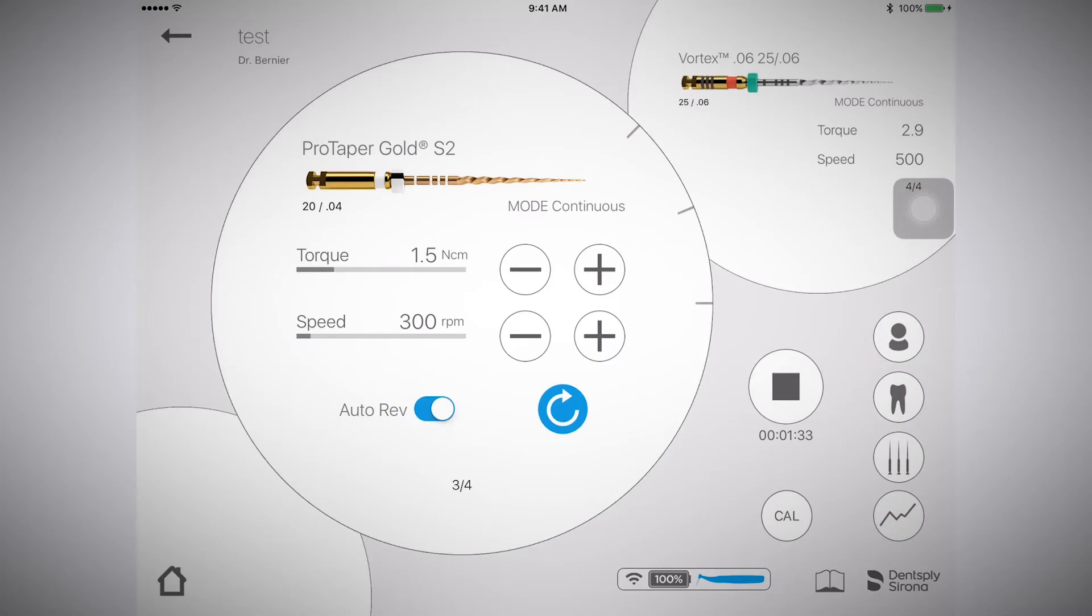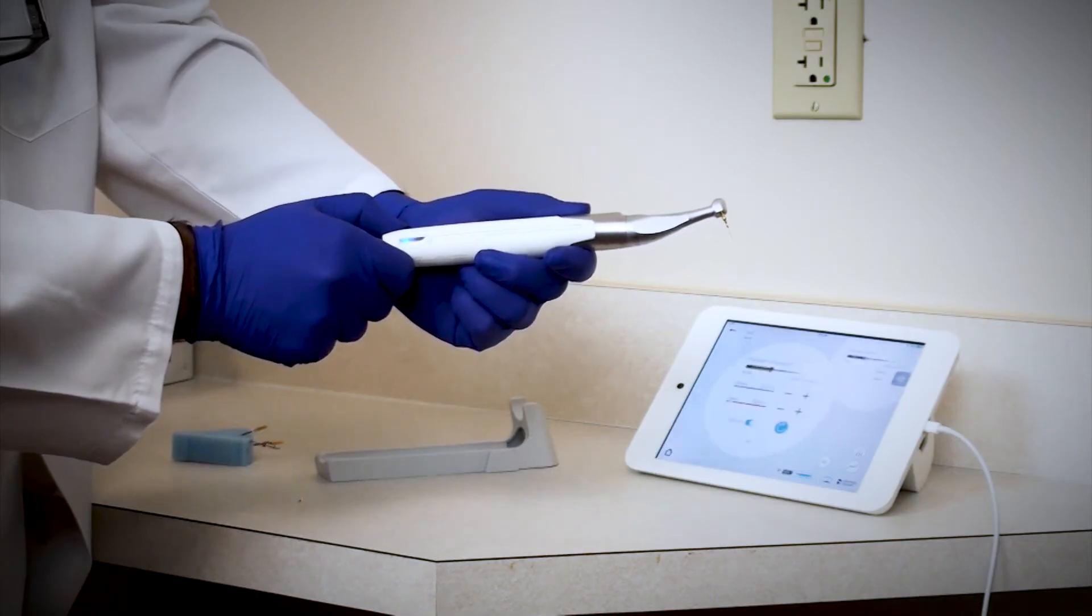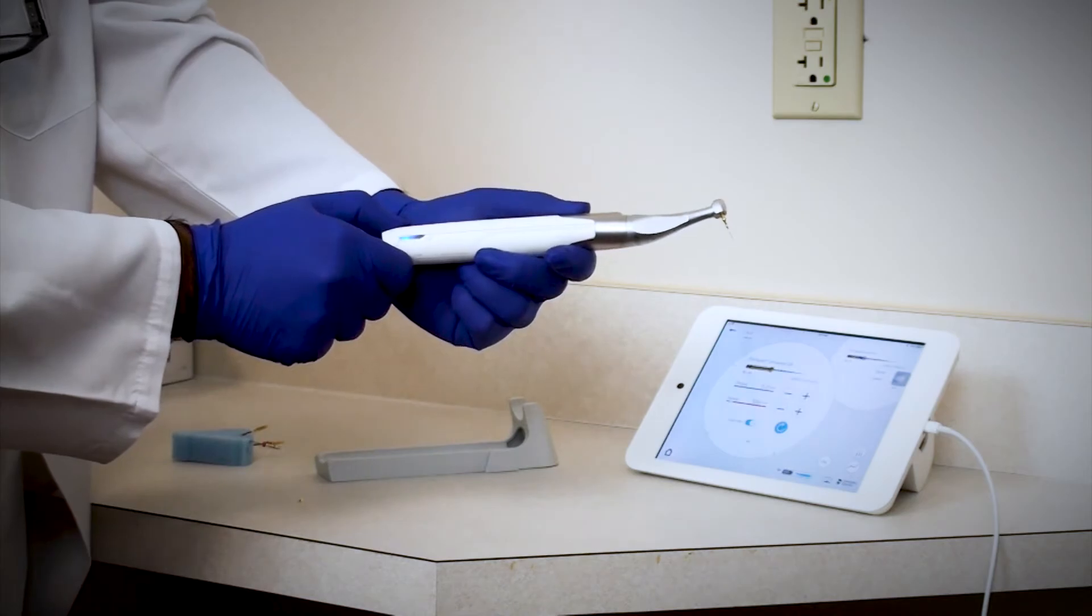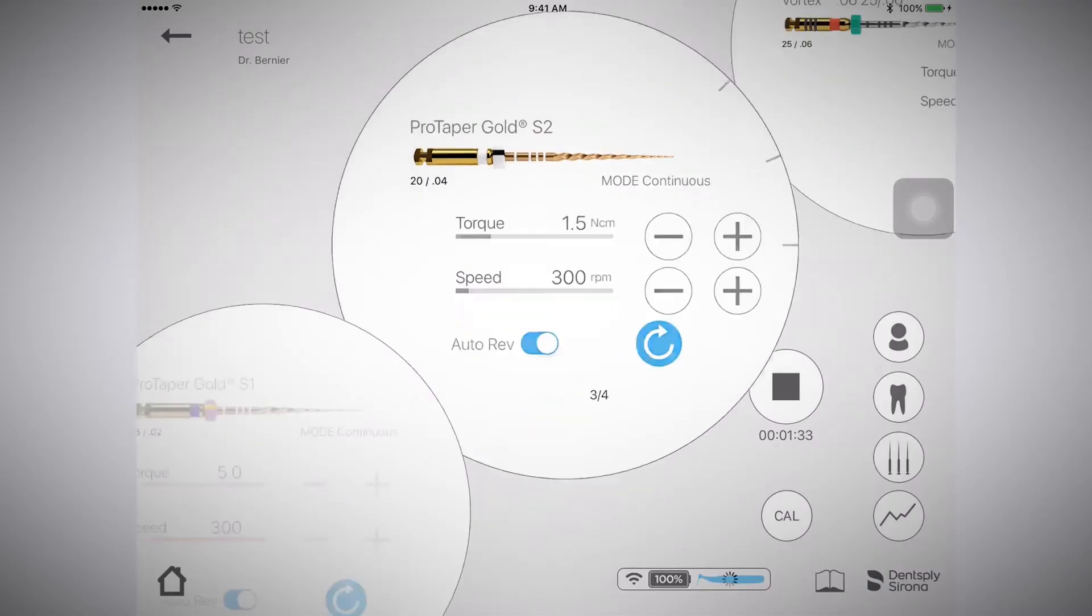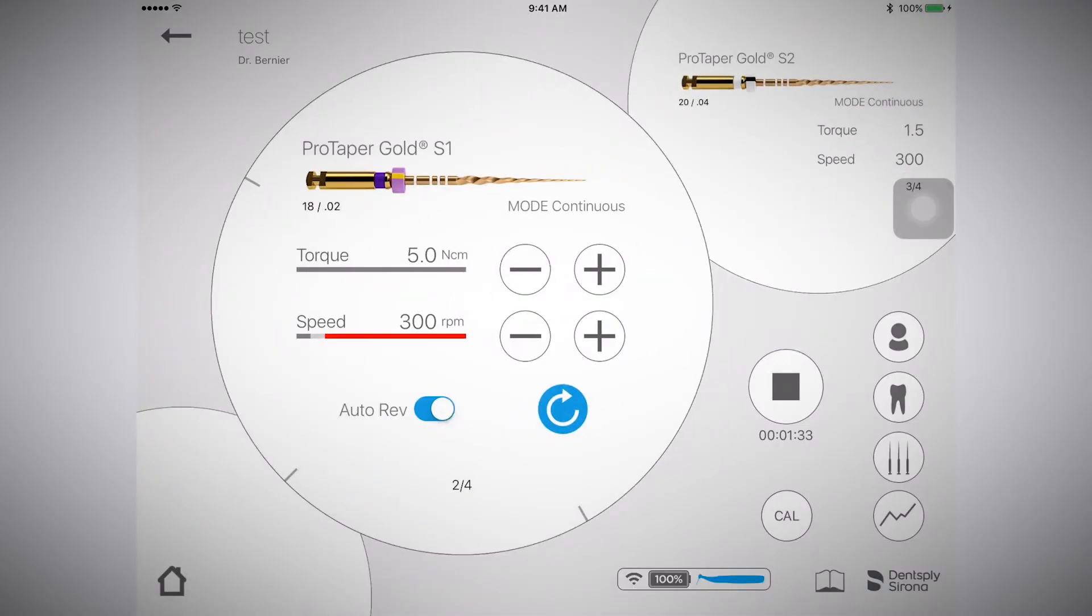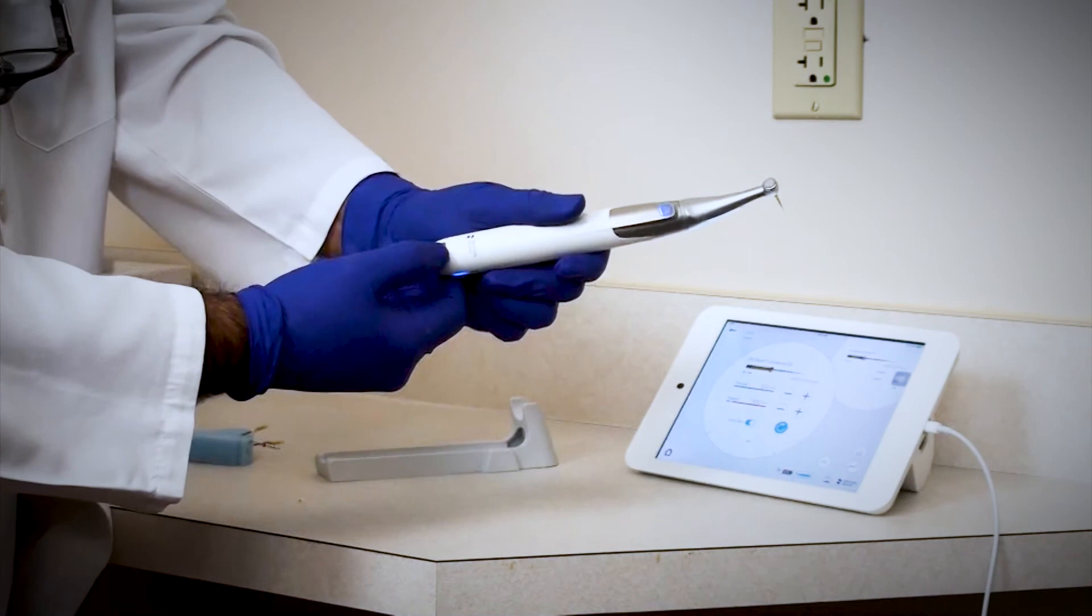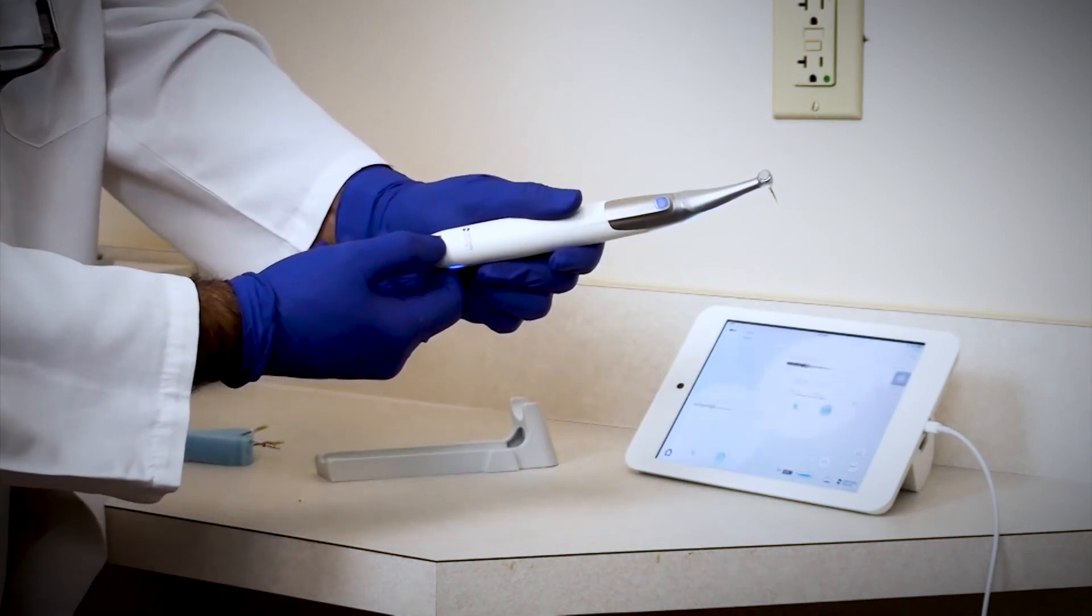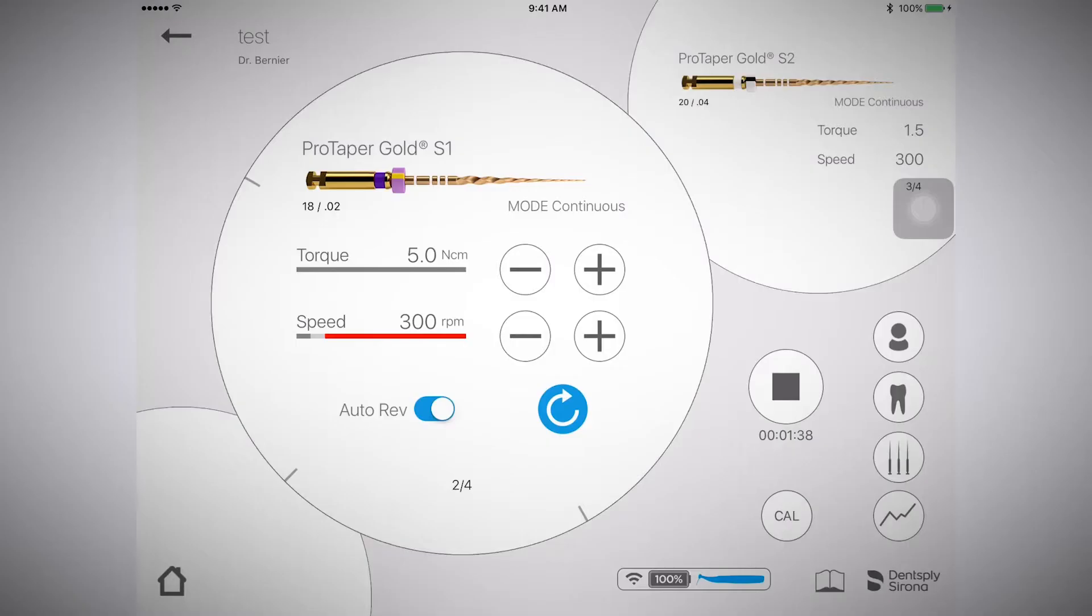If I press the multi-function button twice quickly, it goes backwards. You can go back and forth through files during the course of the procedure without even touching the screen on the iPad.